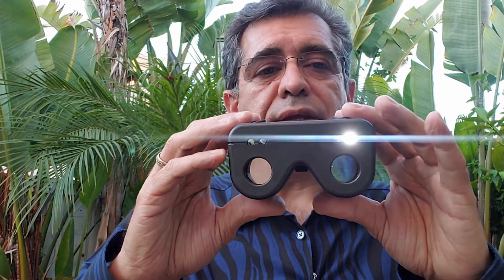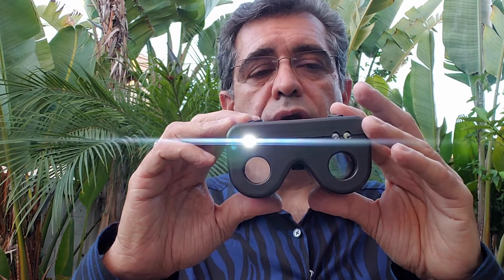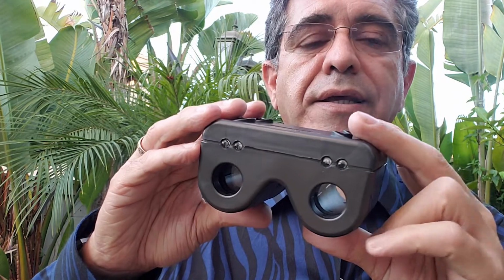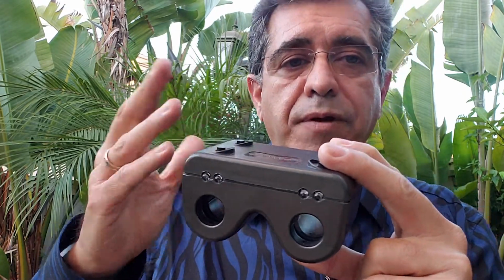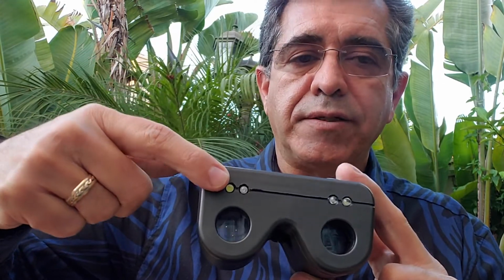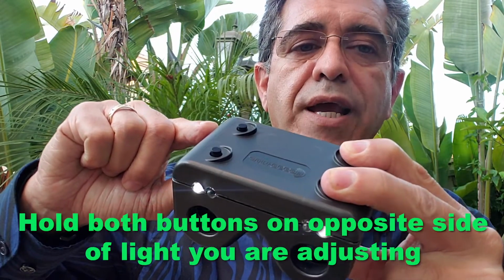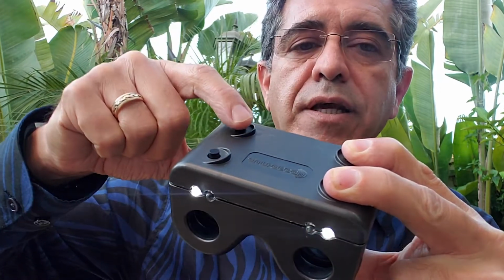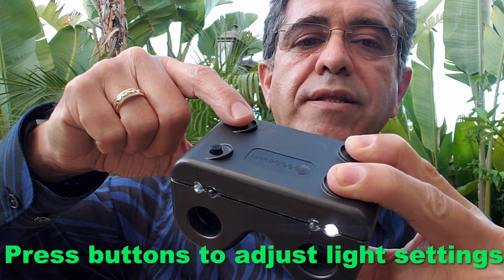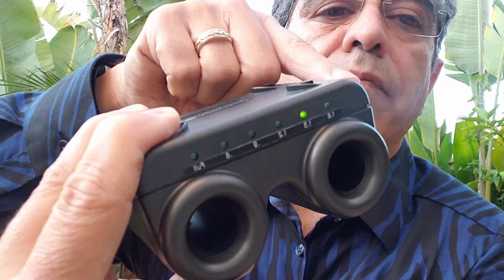I will demonstrate that here. So let's say you have found an APD. Now you're going to dim one of the lights to the point that it would reverse the APD. Let's say the light that you want to dim is this one. So we're going to hold the opposite two buttons together. It flashes a couple of times. Then you press the button sequentially, and you can see the light dimming each time you do that. The level of dimming is present here.